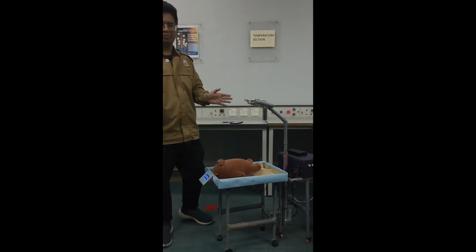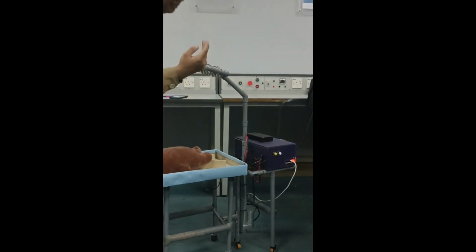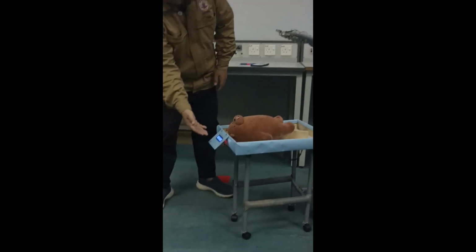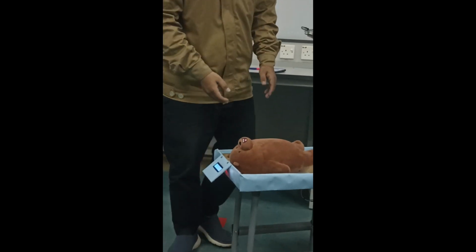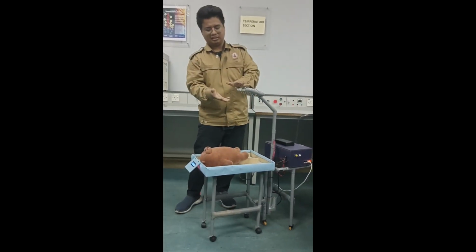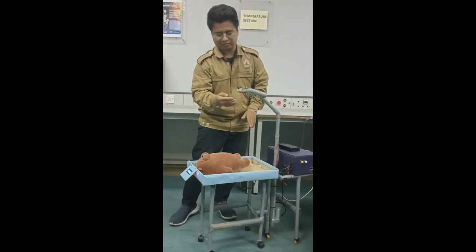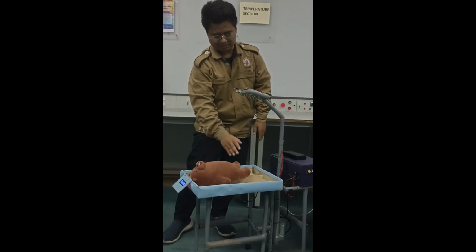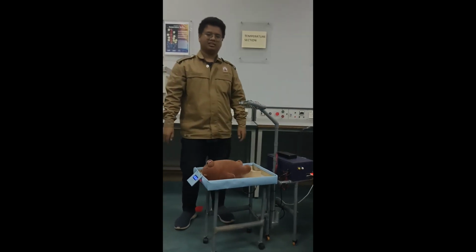What is the innovation? We used Blynk, but we still have a manual button. This is for up and this is for down. This is the LCD, which is for monitoring. And this is the placement for the baby. The distance measured is for this area. It does not detect here, but detects here. That's all for the innovation.